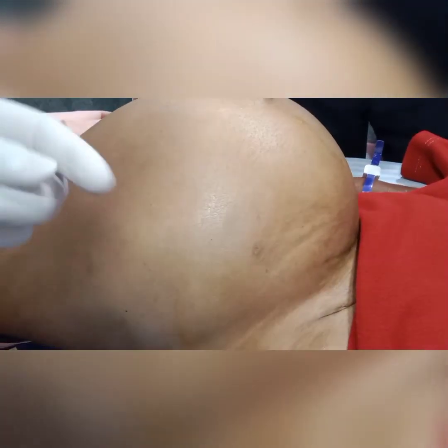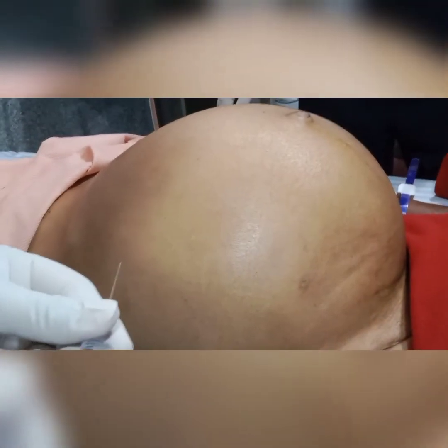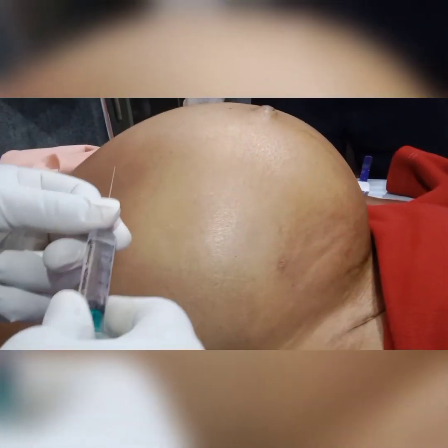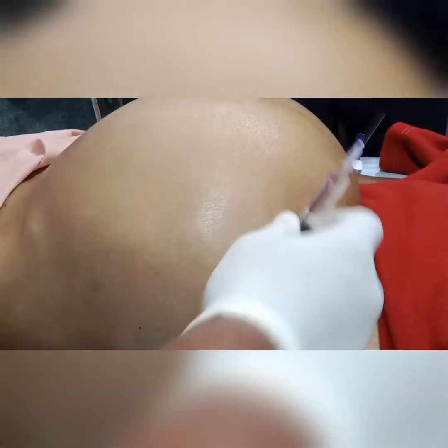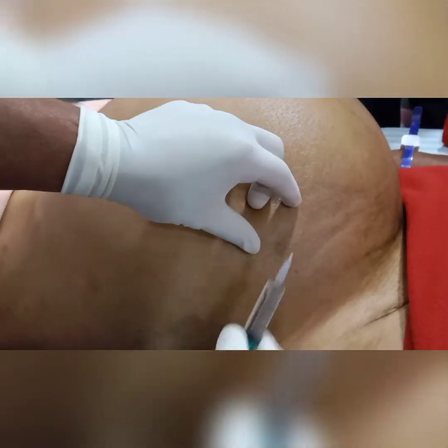Hello, good morning everyone. So here we are performing ascitic fluid drainage. I will be puncturing the abdomen at the right lower quadrant of the abdomen. First, I will give local anesthesia at the site of puncture.